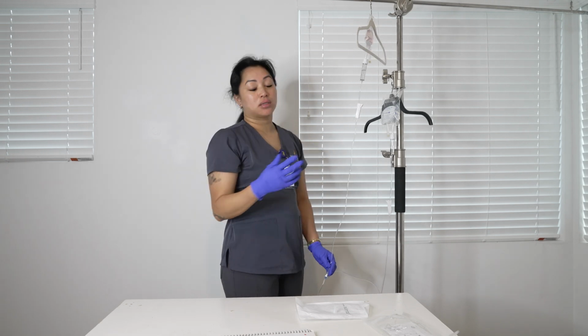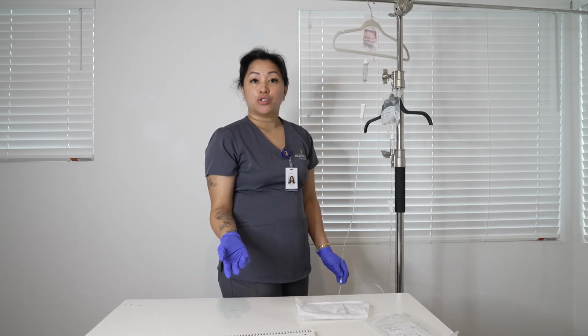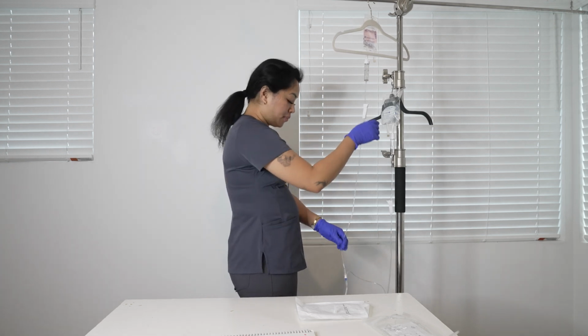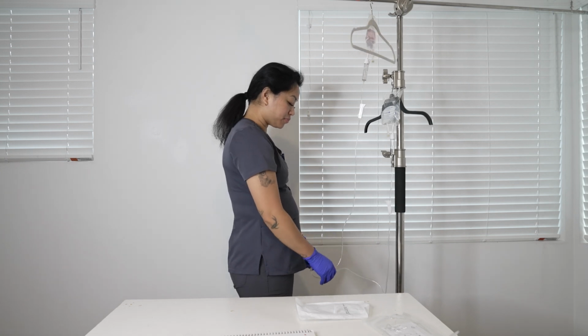So now, since we know that the drops per minute is 100 drops per minute for the amoxicillin, but before that, let's take out some air bubbles.